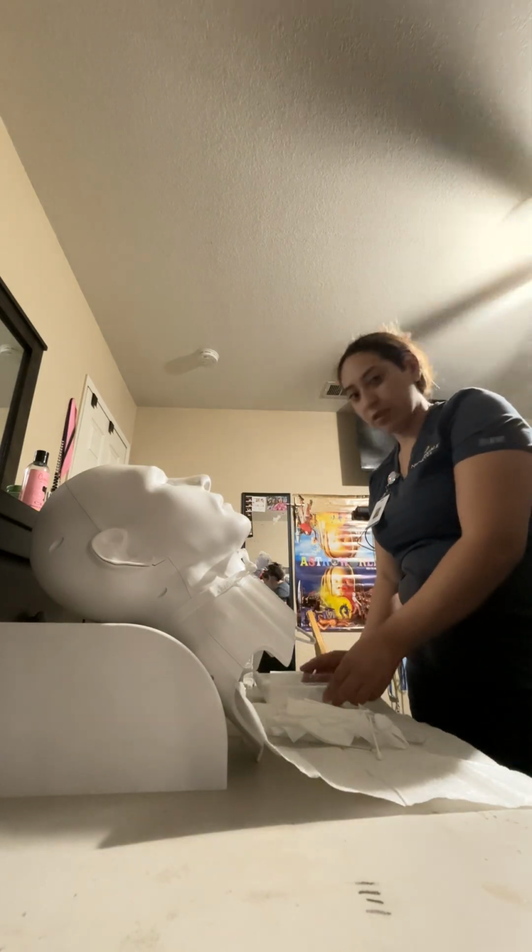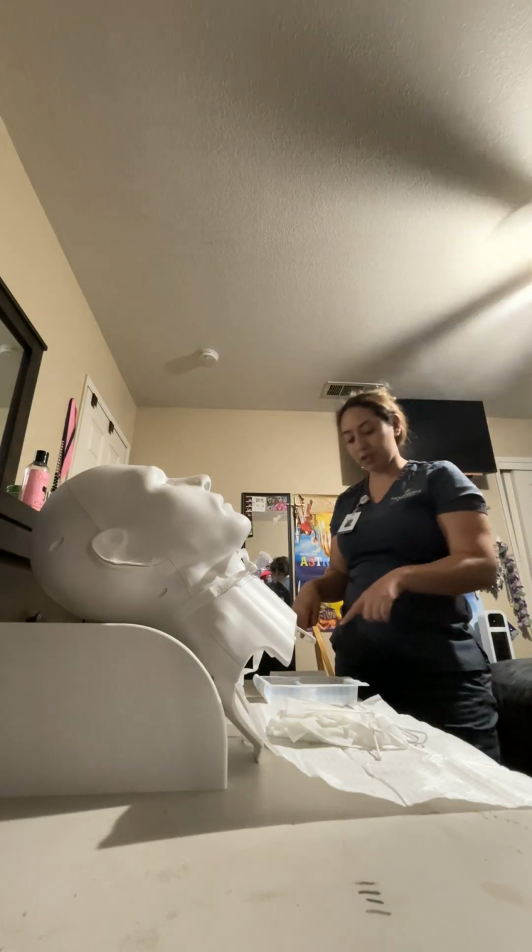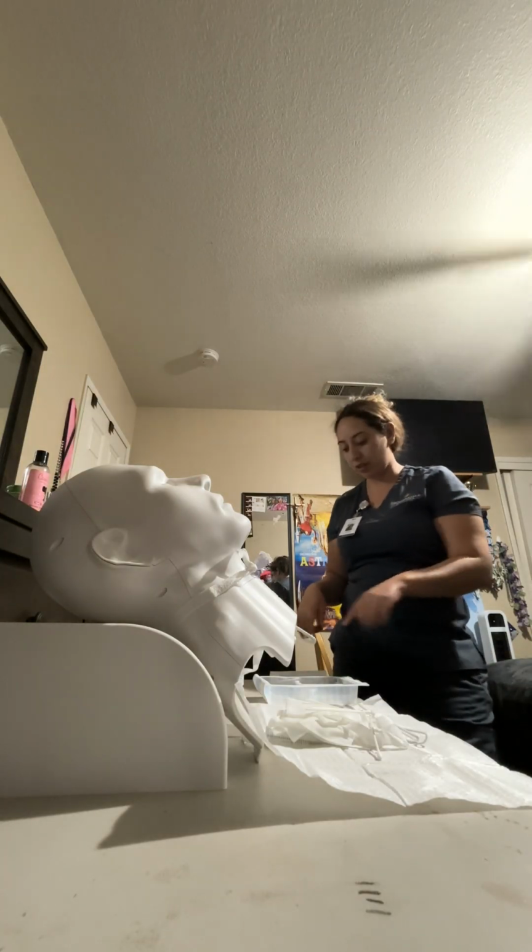And I'm going to save this sterile tray here because I will be using it to pour my cleaning solution as ordered. Today's order, doctors ordered the tracheostomy site to be cleaned with normal saline. I have 3 chambers here, and I'm going to fill all 3. So here is my cleaning solution. I'm going to add cleaner here, cleaner here, cleaner here, and I'm going to put this to the side for a later time. Okay, my hands are still clean at this point. I'm going to open up my sterile gloves and apply those to get started.